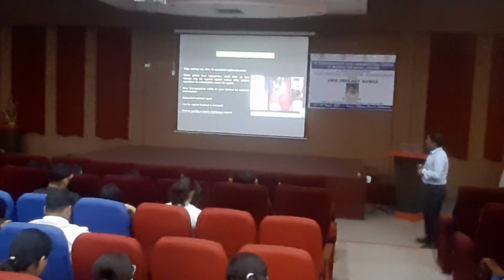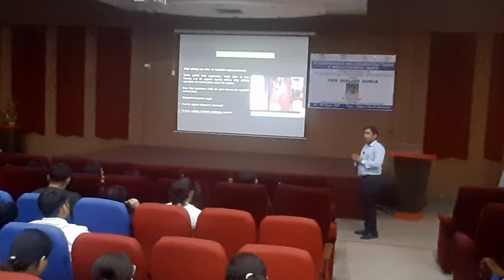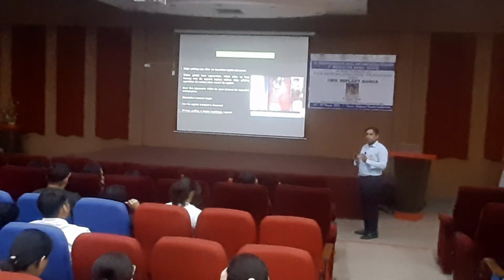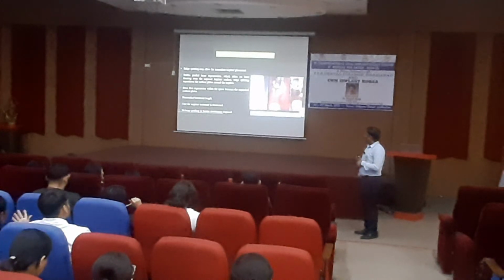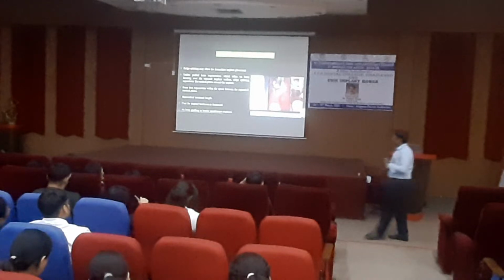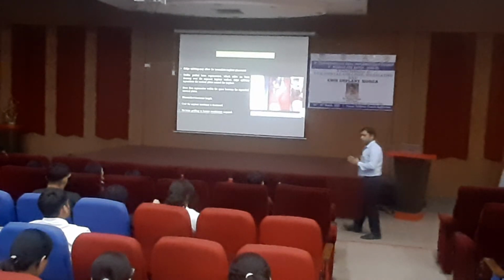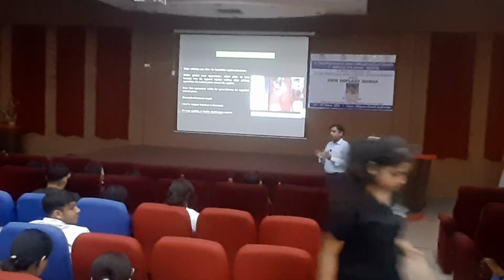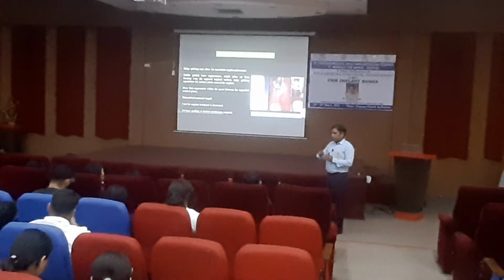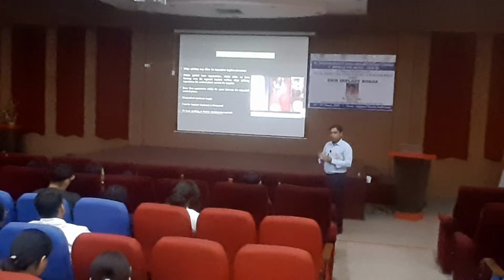Advantage over grafting: the ridge split may allow for immediate implant placement. Obviously, if you expand the bone, you get a good amount of horizontal width, and you can place an implant easily. Bone then regenerates within the space between the expanded cortical plates. Most of the time we do not need any type of graft once we expand it and place the implant simultaneously, because once you expand it and place an implant, there is a blood clot surrounding it, and that blood clot has to form new bone.